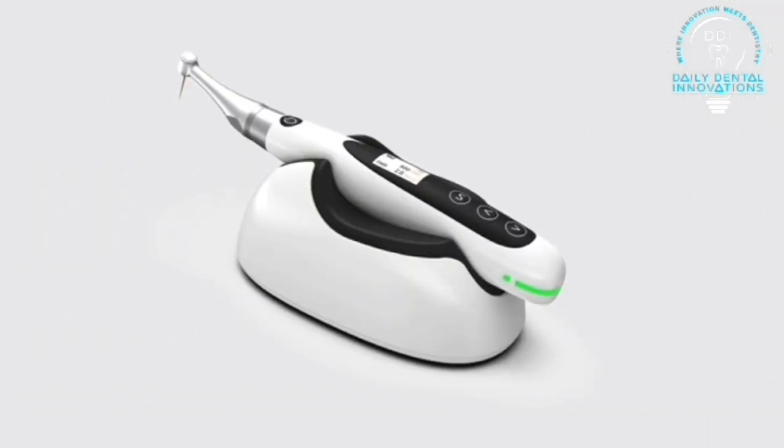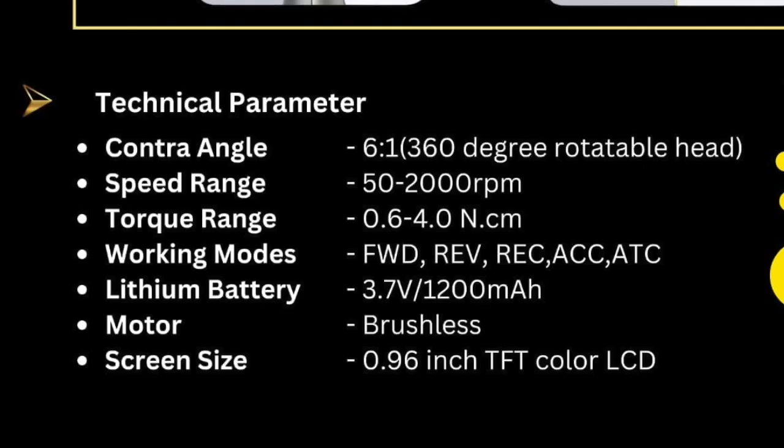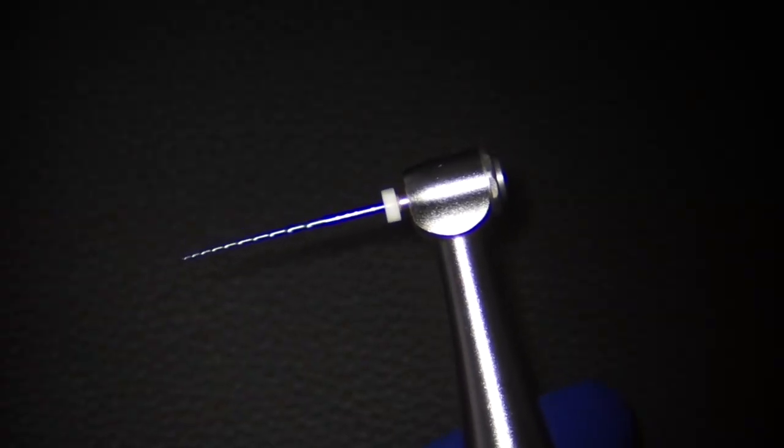The speed range is again good, with 50 to 2000 RPM, which is a very wide range. It also has ACC and ATC mode, so apart from continuous rotation it has a reciprocation mode.